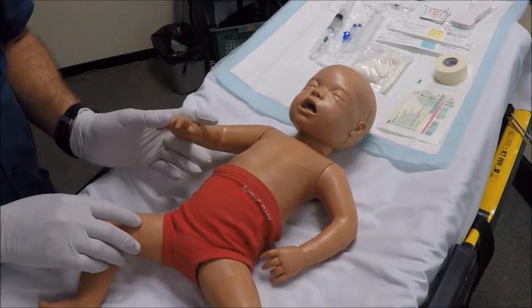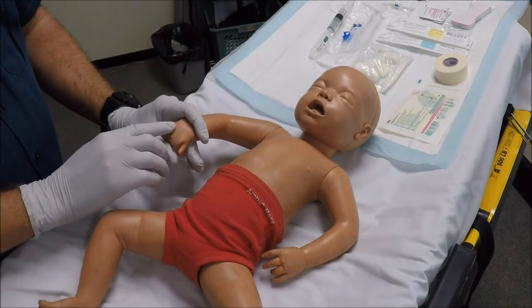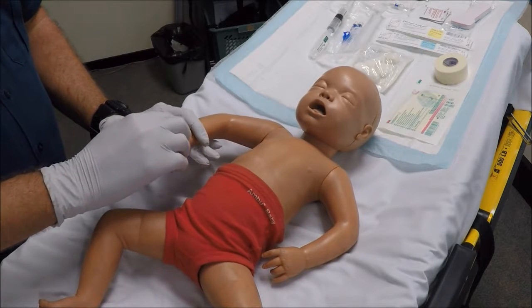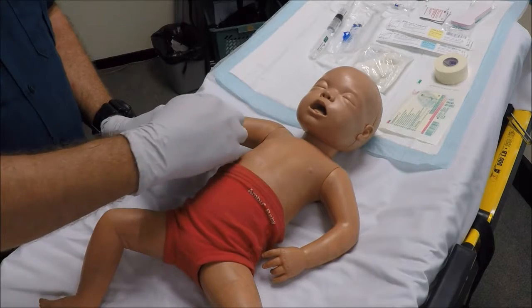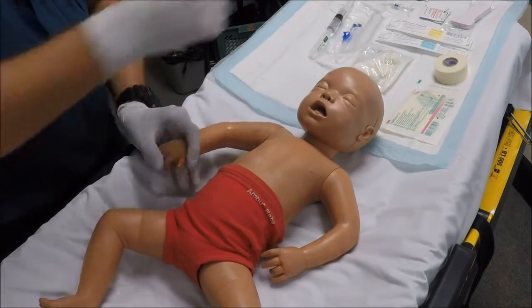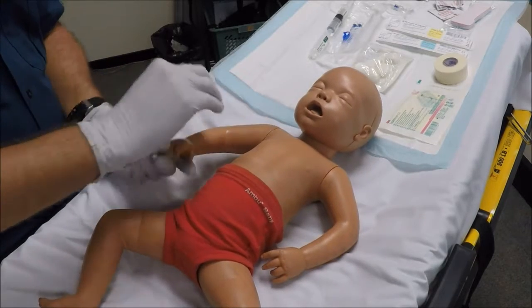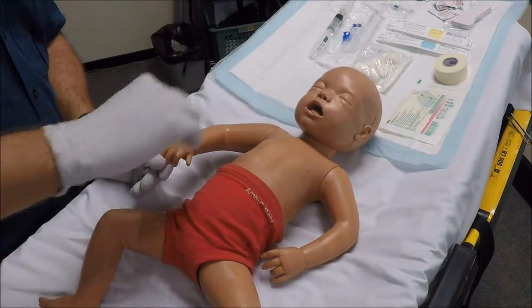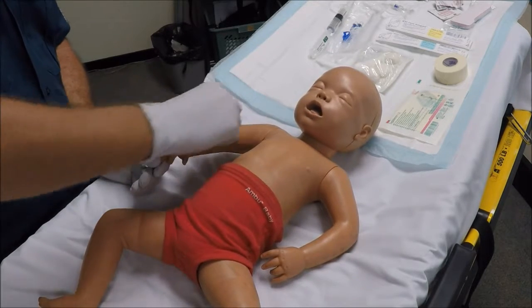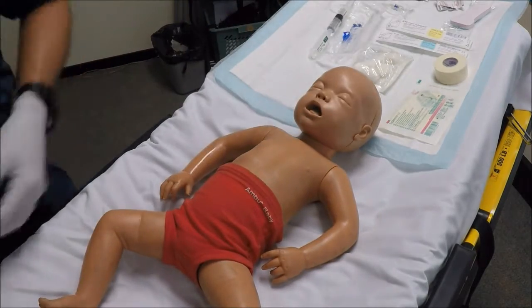With very young paediatric patients, one way to facilitate a good presentation of the vein is to use a single-handed technique — fold the patient's fingers under and apply traction downwards on the dorsum of the hand. The vein I typically aim for is between the fourth and fifth metacarpal. In a slightly larger patient it's also helpful to have a second person apply traction upwards in the opposite direction. In terms of patient preparation, we want to ensure aseptic technique by cleaning the site effectively.